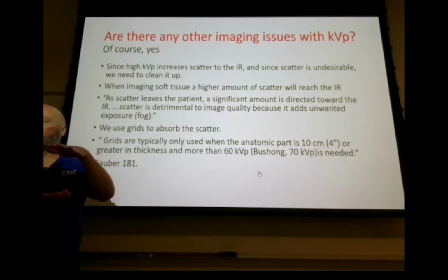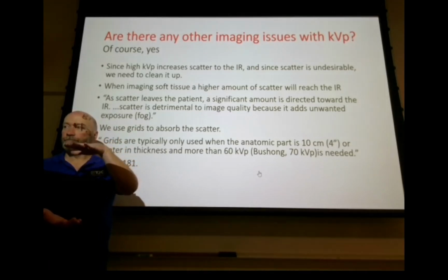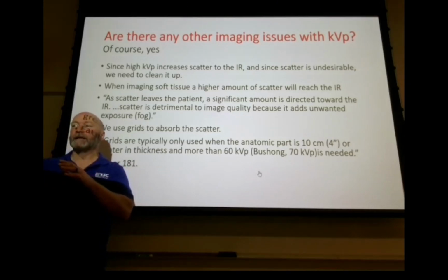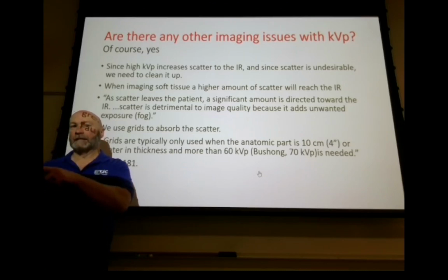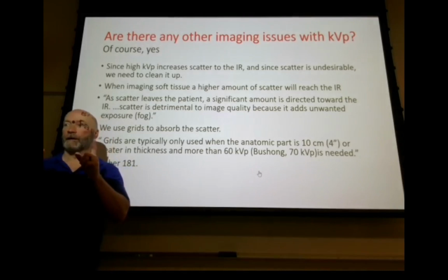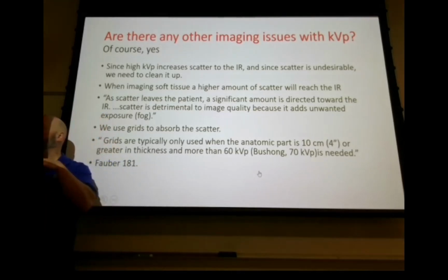So what's the other thing then? So we got the thickness of the tissue. What's that? The type of tissue, we already said type of tissue really doesn't matter all that much. It does in transmission, and therefore, since it does in transmission, we may still have to deal with it post-patient. But I'm talking about creation at this point. Exposure of tissue, right?